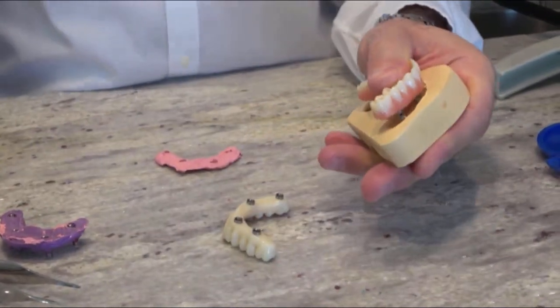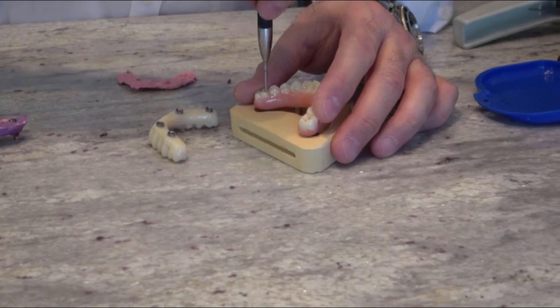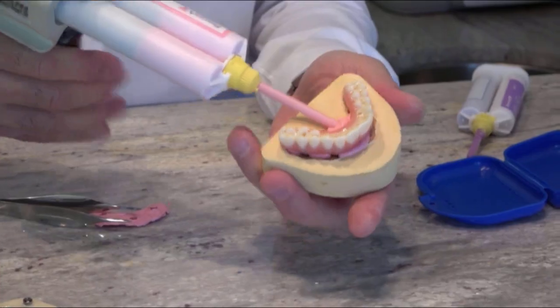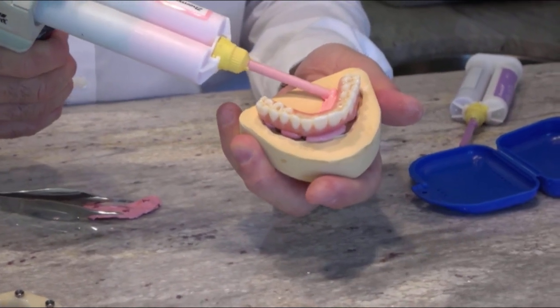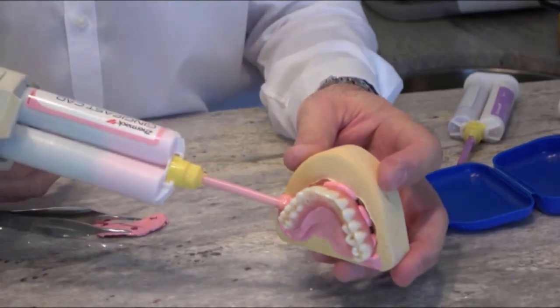This is the master model. You screw everything in, inject it really hard so you can see it's coming out from the other side, and squeeze more than you need because we can always cut away the excess. See how much more I put in and you see it comes out from the buccal?